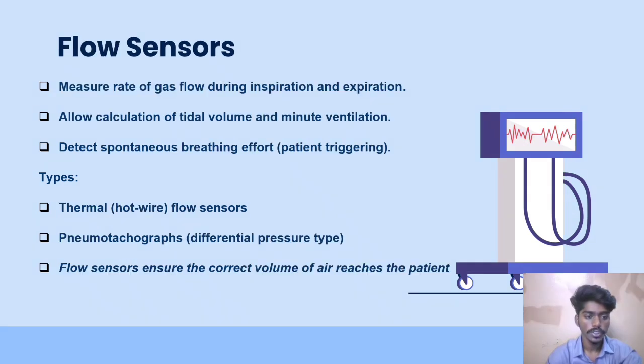Then coming to the flow sensors. Flow sensors measure both inspiratory and expiratory flow. They help in calculating tidal volume and minute ventilation. They also detect whether the patient is trying to breathe on their own. The types include thermal.